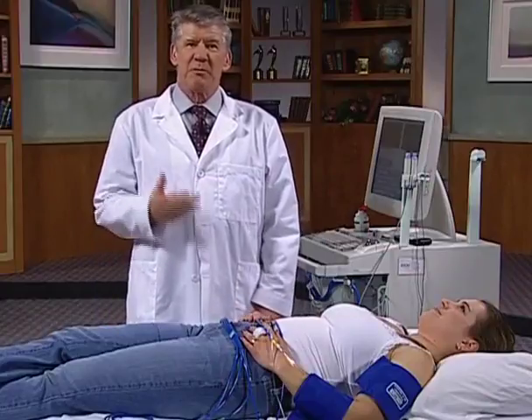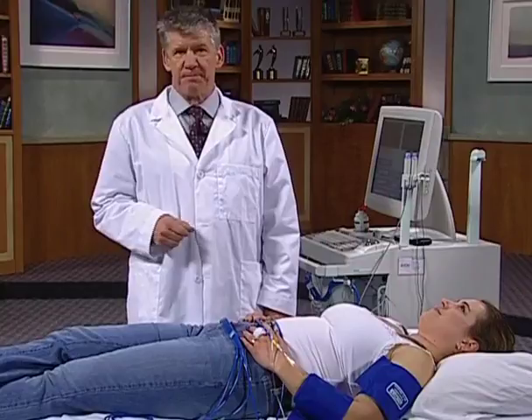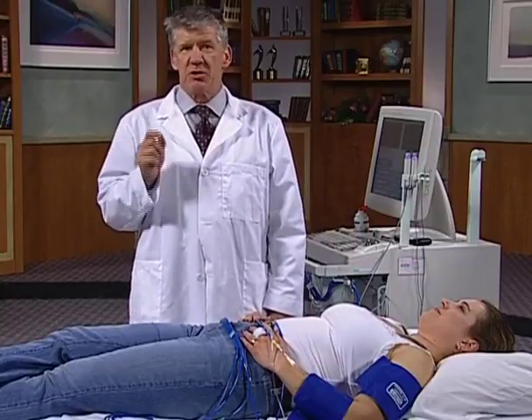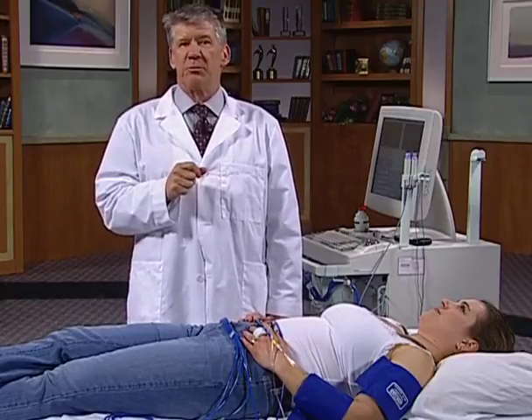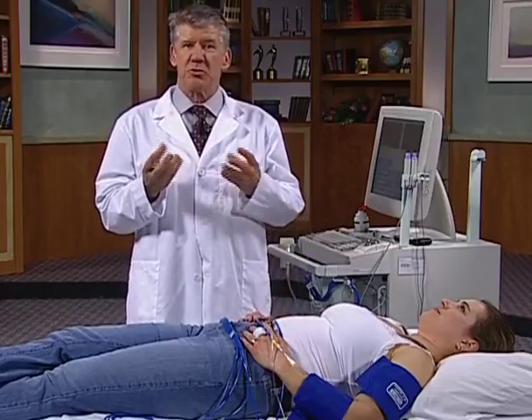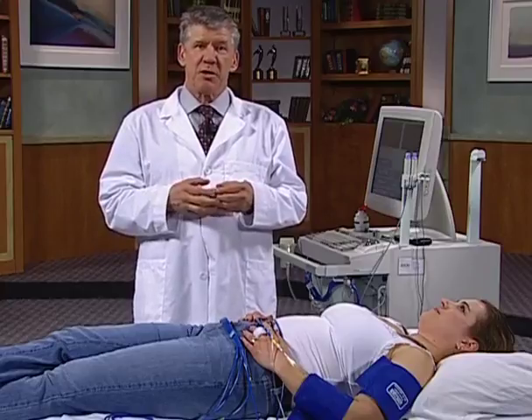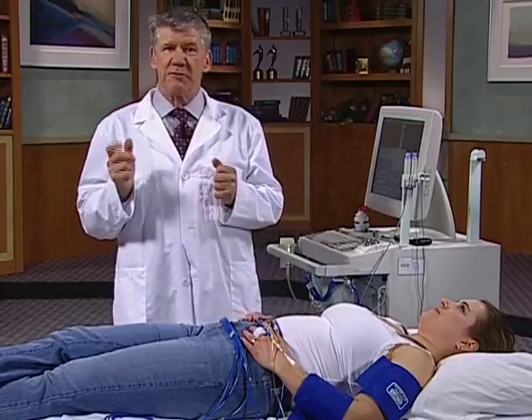Hello. I'm going to demonstrate how to perform an upper extremity physiologic examination. Before we start the exam, though, I'd like to give you some advice, and that's the patient should be in a warm room, or the testing should be performed in a warm room, because if the room is cold, there's a vasoconstriction that takes place, and it makes it difficult to evaluate the digits. So this is the same rule that we use for the lower extremities. Test in a warm room for physiologic testing.